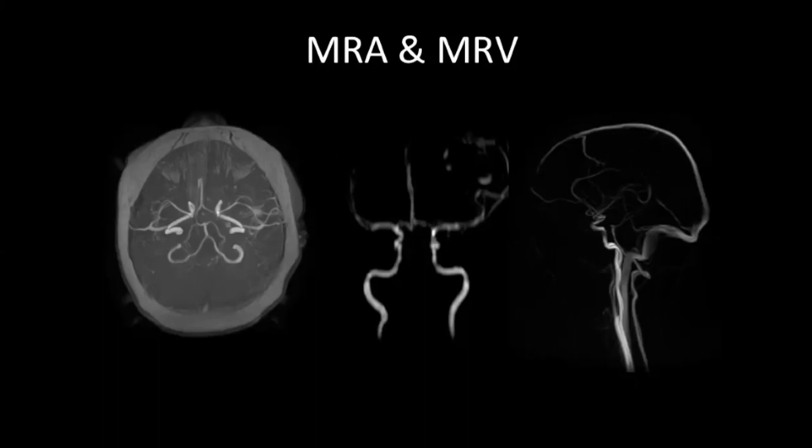Okay, so will you label this as an AVM on these images, or will you give some more road mapping to the clinician? Ma'am, maybe I will go for the conventional study to look for the draining artery and the draining vein and the feeding vessel. Okay, so you will go for a DSA, right?